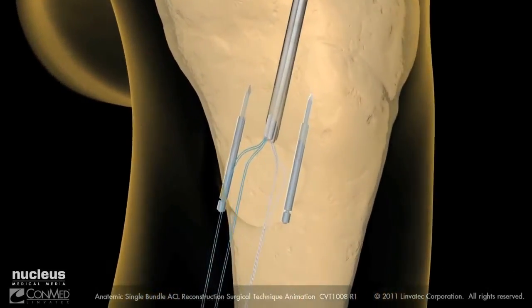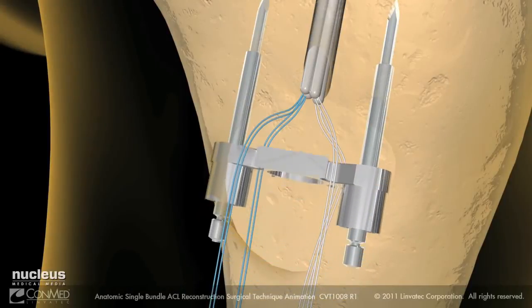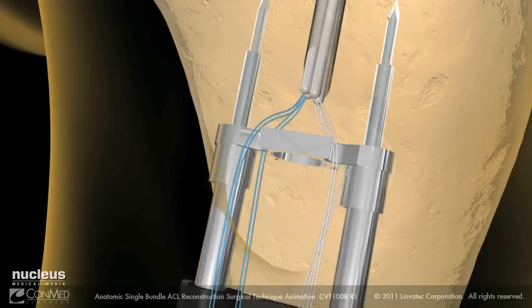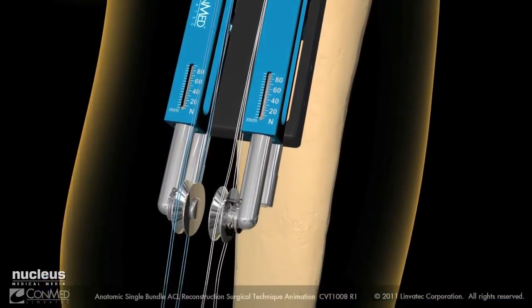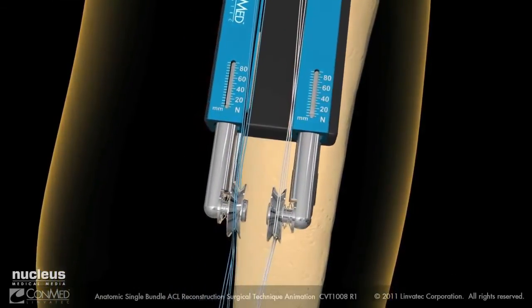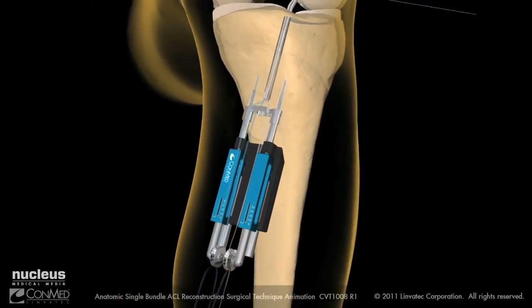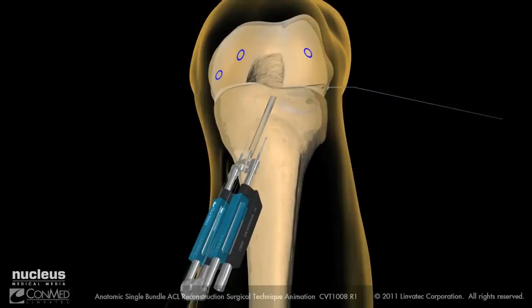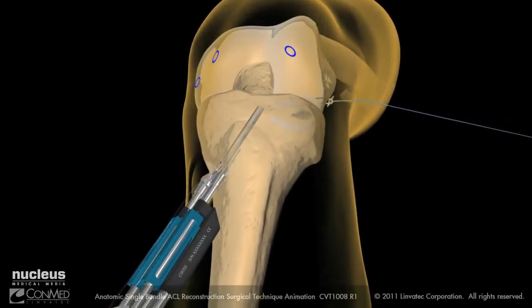Load the SE graft tensioner suture separator. Spread the whip-stitched strands radially as you load the SE graft tensioner. Tying the appropriate bundle strands to the left and right tensioner wheels allows the bundles to be individually and accurately tensioned. Apply the desired graft tension and then cycle the knee to alleviate laxity. Hold the knee at 15 degrees of flexion and set the desired final tension.